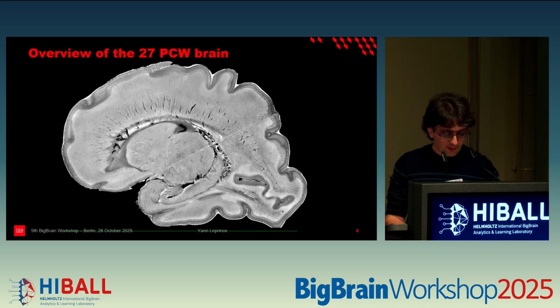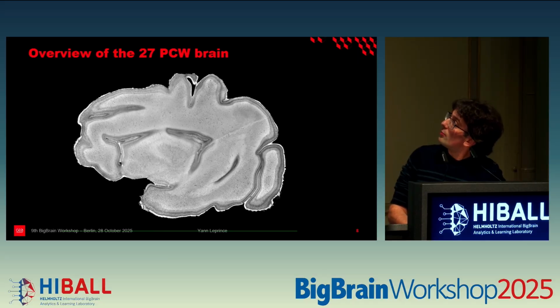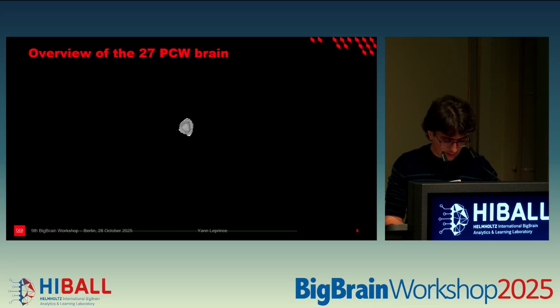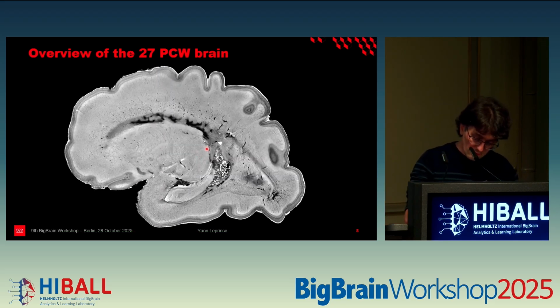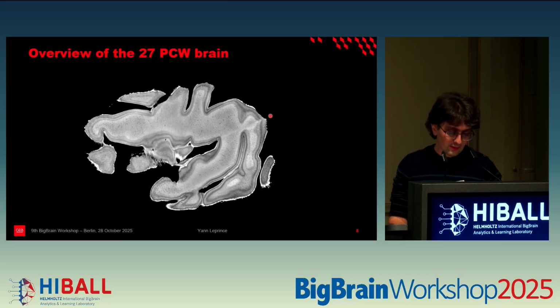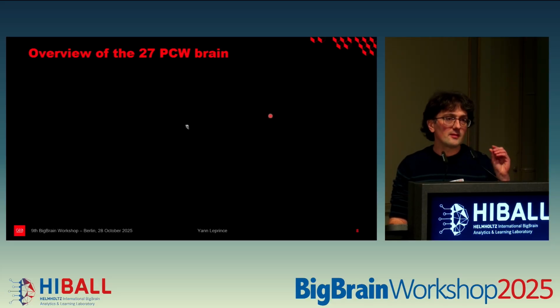So this is the 27 post-conceptional week brain, and you can see, let me play it again, you can see here that we have a junction line that is quite well handled by the registration, although it is not perfect in the immediate vicinity of the cutting plane.